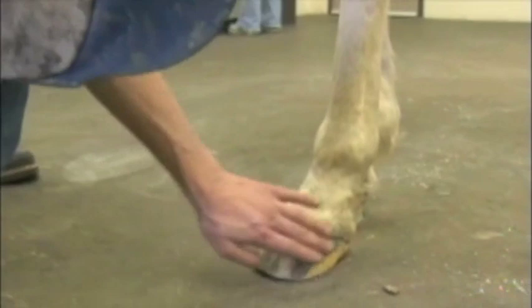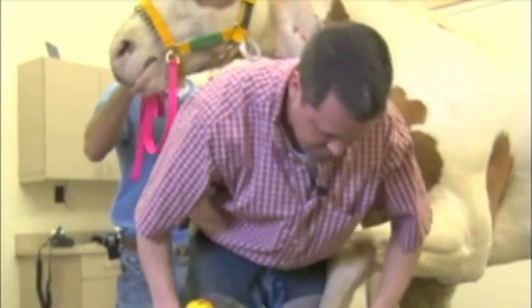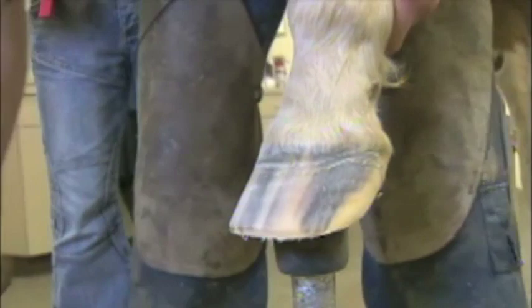We're really just using the Equilox on the outer surface of the foot, so we're just going to clean up the outer surface. We don't really need to do so much on the bottom, along the angle of the bars and on the sole surface of the foot - it just gets adhered to the outer hoof wall. So we'll just clean that up with a sander. Just clean up the wall a little better, give it a better shape.